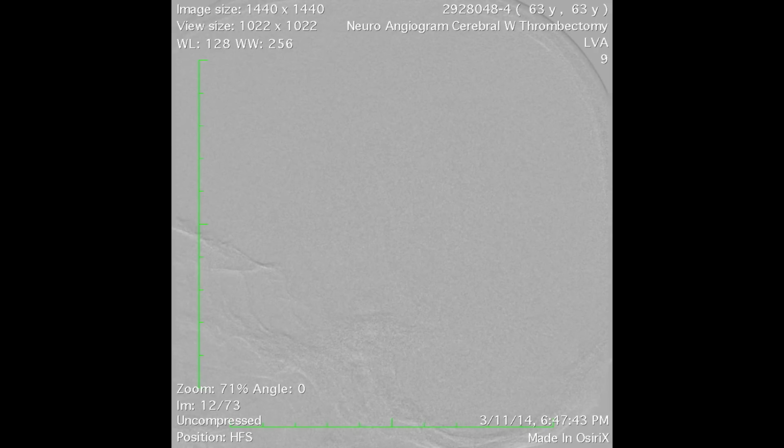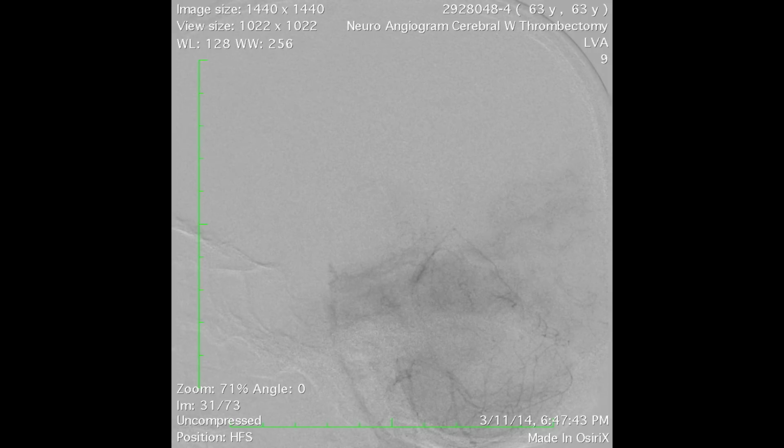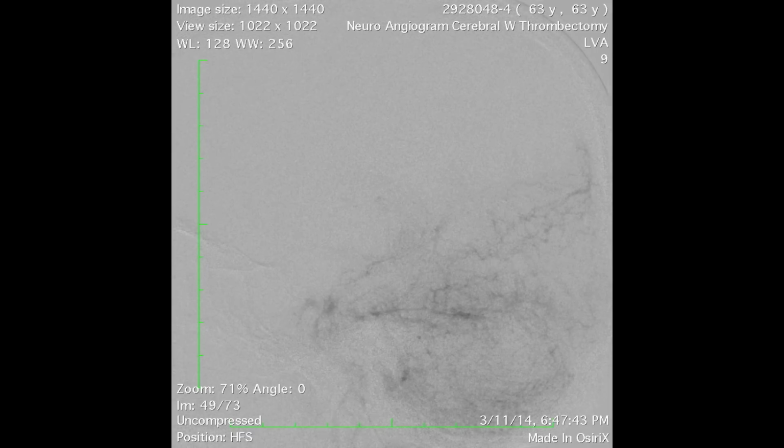Important to see that even though the straight sinus was patent, no egress was possible because of a clot present at the torcula and across bilateral transverse sigmoid systems.